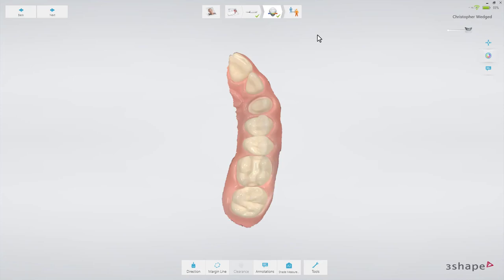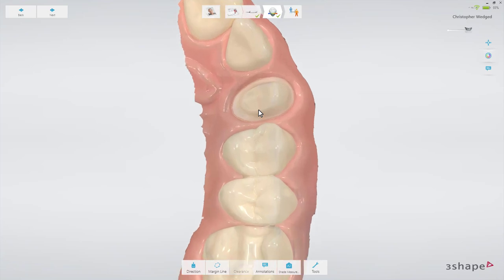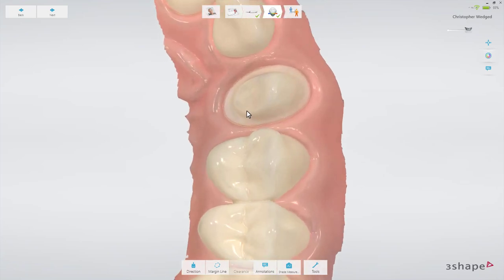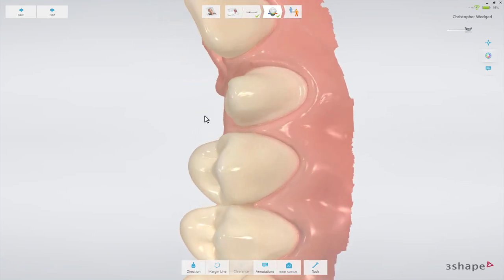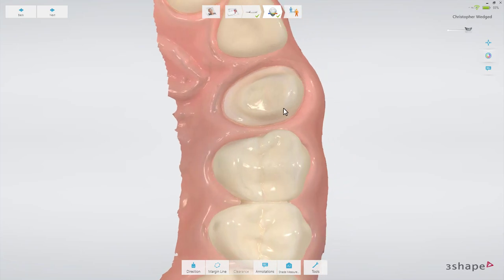Now the case is post-processed. Note how the level of detail has now increased. The dental lab will always see the post-processed scan, because it is automatically processed during the sending procedure.